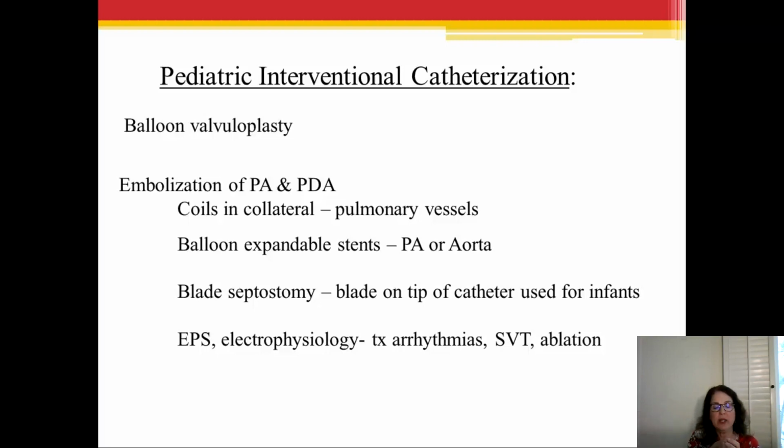So if I go in and fix it and we put in a graft, so now there's a pulmonary artery, they're going to get too much flow, right? It'll be excessive flow because of all those collaterals. So what we'll do is bring the child in and do the right lung first, and may spend hours in the cath lab coiling all those collaterals on one lung. Then the next time the kid gets more cyanotic, next go to the other lung next month, coil, now he's really cyanotic, and then you take him to surgery to repair. So you've got a more balanced flow. You're trying to balance the flow to the lungs.